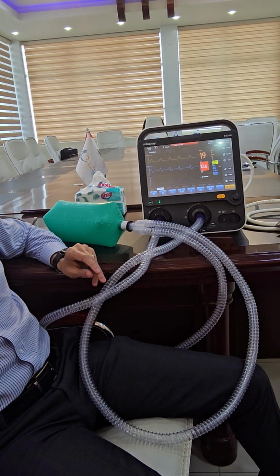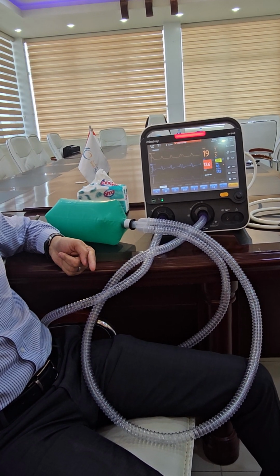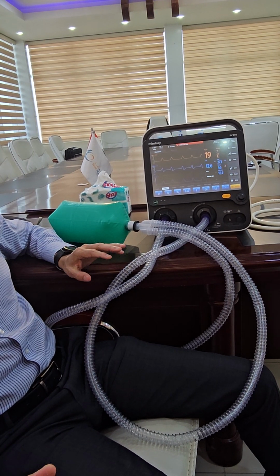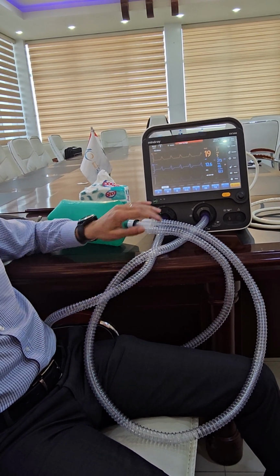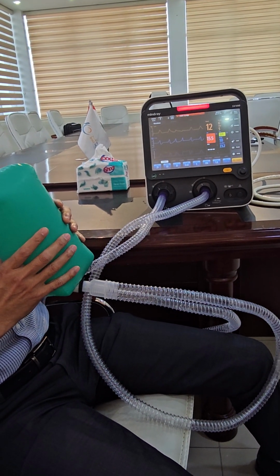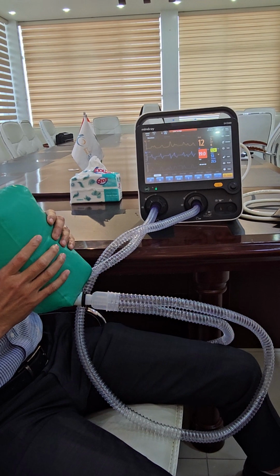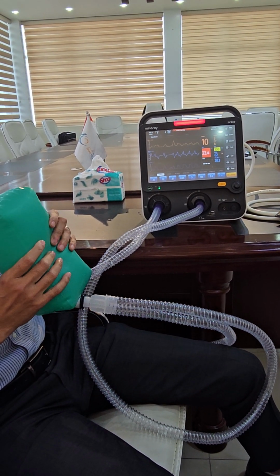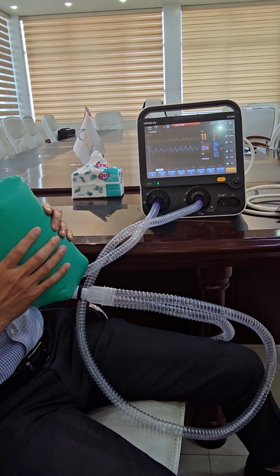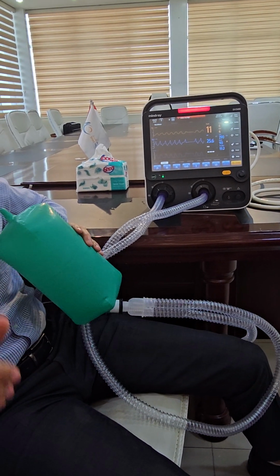Second, the rate. You set the control rate. But if the patient breathes more, the machine will not leave him, because it will trigger and give assisted breaths. So you'll see the control and the assisted. Let's say the rate now is 30. Let me breathe faster. Look at the number, the red one, the rate, increasing. Whatever you set, the machine will give.